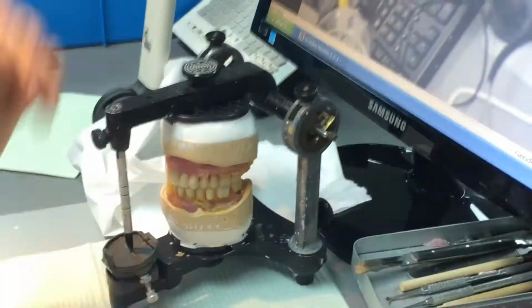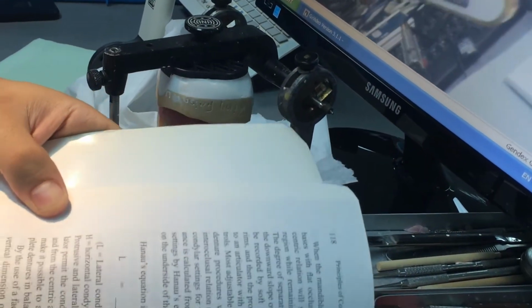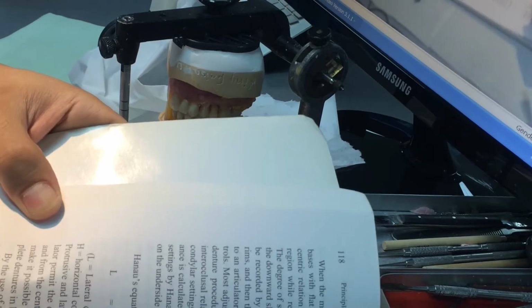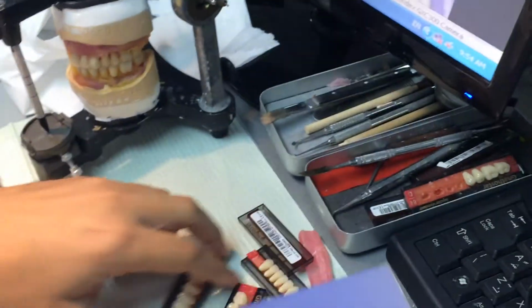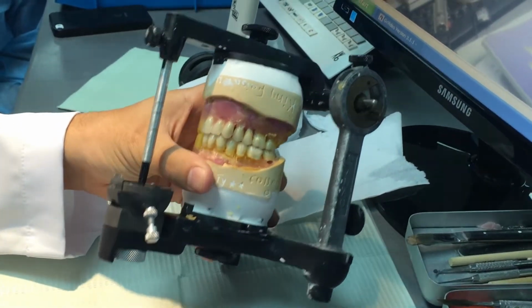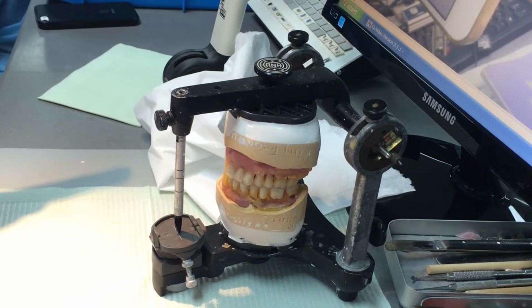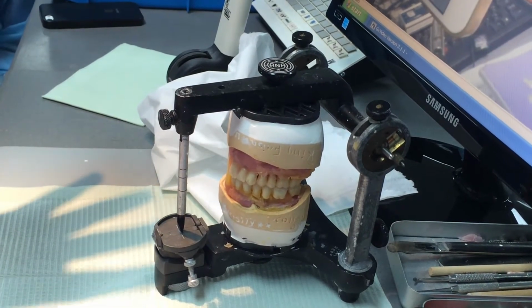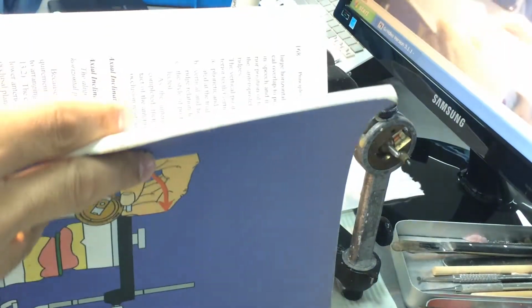So let's start, guys, how to do the setting. Our reference, or let's say our guide, is I think the Hasballah book. First of all, I'm going to do the setting for you for one side, like what I have done here, one side, anterior and posterior. And you guys are going to do all of them for sure, but I'm doing this in order to save your precious time. Okay?